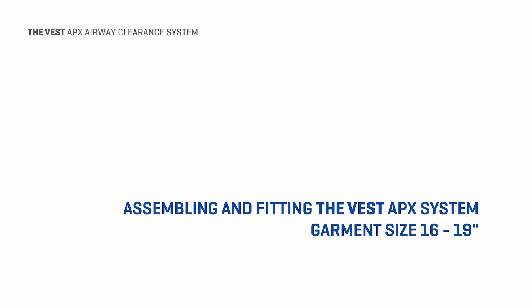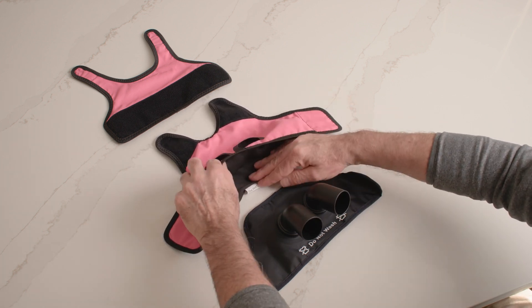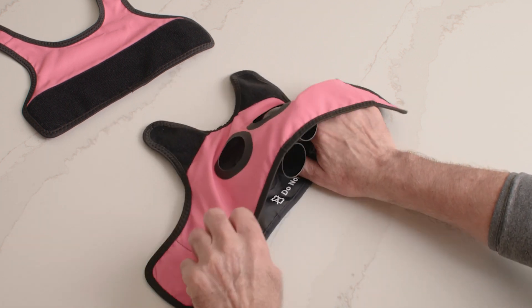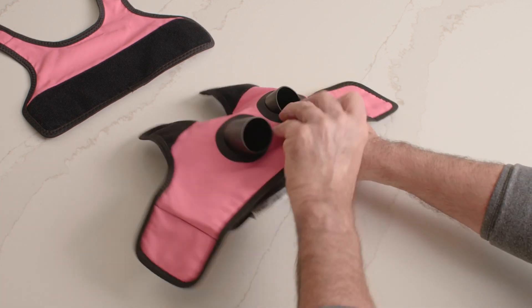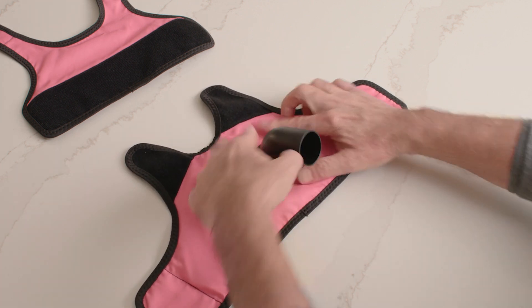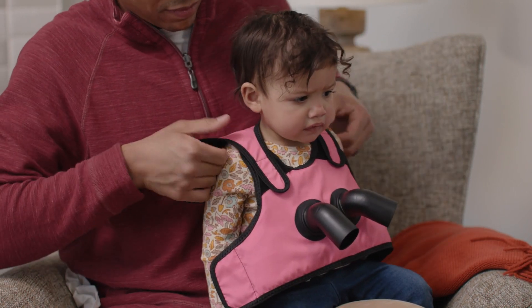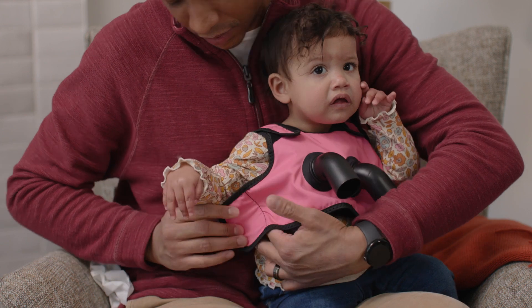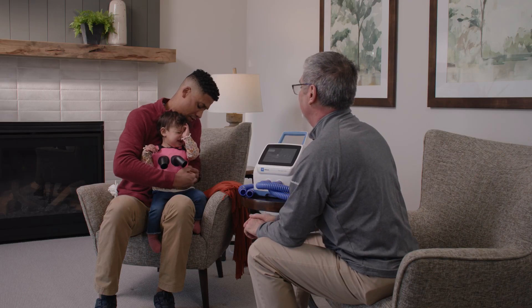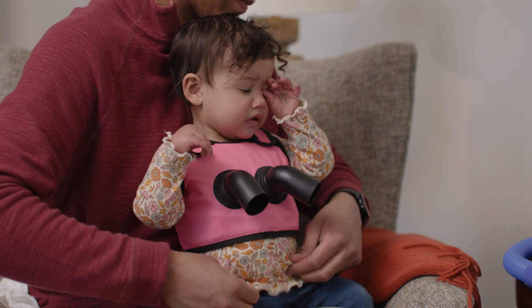The Vest APX system garment will be shipped to you in three pieces. Follow these steps to assemble the vest garment for sizes 16 to 19 inches. Place the outer garment and the inflatable bladder on a flat surface. Open the flap on the bottom of the outer garment. Slide the inflatable bladder into the outer garment. Ensure you push the edges of the bladder out so it lies completely flat inside the outer garment. Put the air hose ports through the air hose port openings and make sure they are held securely in place. Put the garment on so that the air hose ports are in front of the patient. Attach the closures so the garment fits loosely over the chest. Adjust the shoulder straps so that the arm holes fit snugly. You should be able to fit a flat hand between the garment and the body before you inflate the garment.